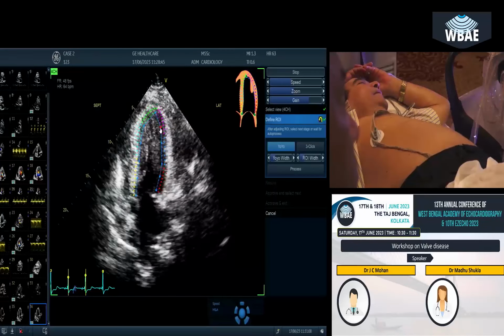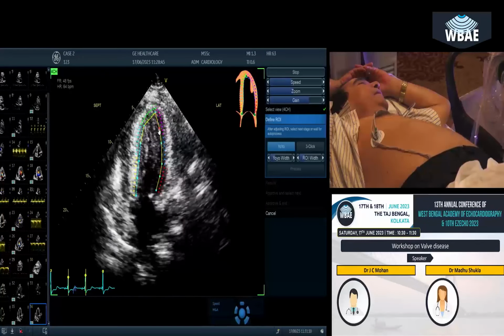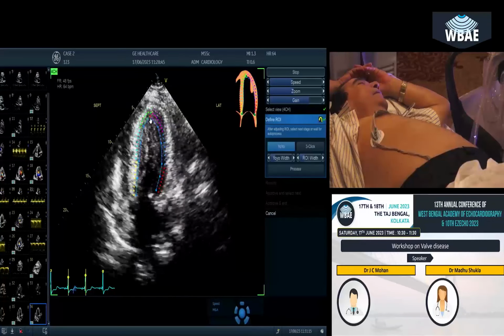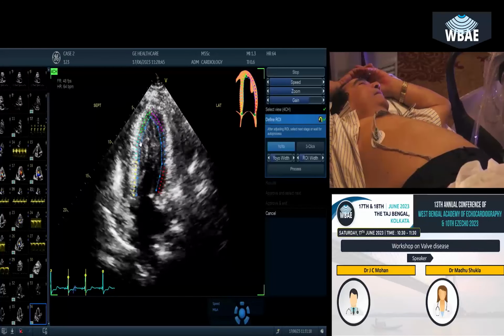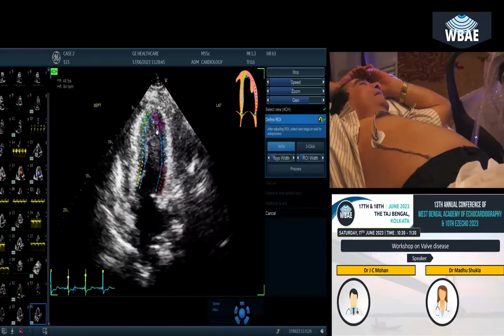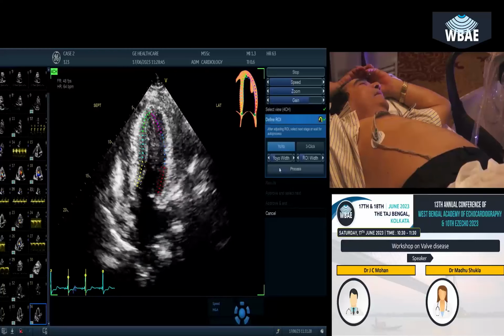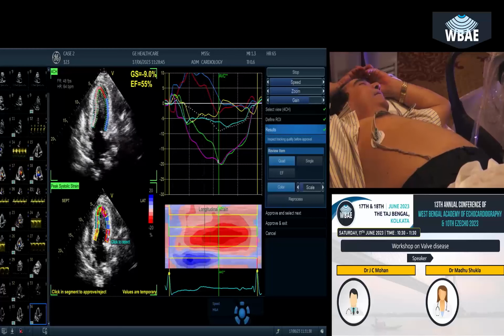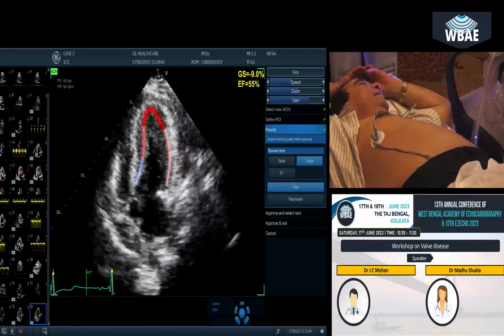The machine is tracking itself. Same thing on the septal side also, more inside. We didn't do tissue Doppler, but anyhow, let us see that. Okay, put some value to this. Now it is correct. So the septo-apical, if you look at the septo-meso.